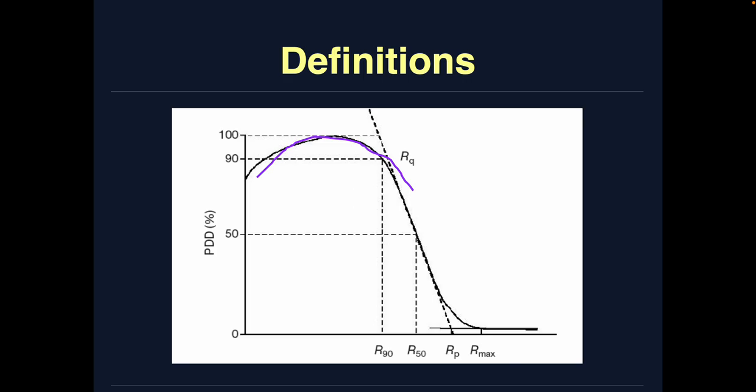This curve is very, very important. The blue line you can see here is nothing but the area where you want to put your target, and we discussed this in detail. Please, for this curve, you have to be aware of how to draw it, and you have to be aware of all the definitions on this curve for your exam.